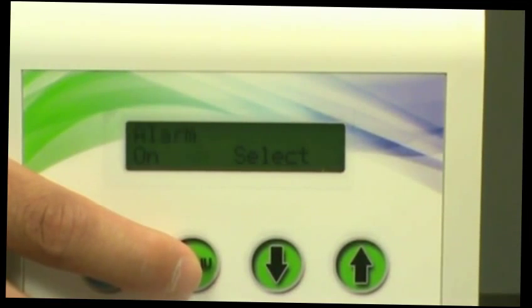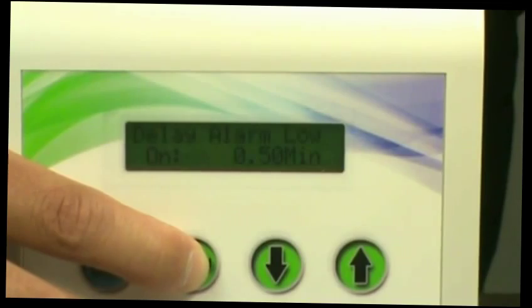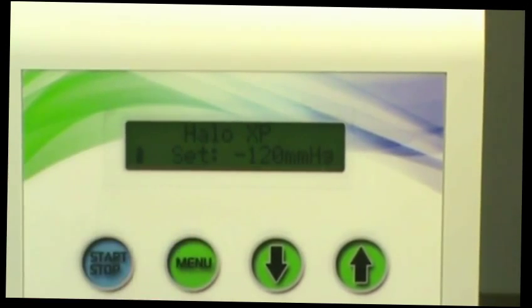Your alarm setting, make sure it's on. Your delay alarm setting as well. And this one we set it up for half a minute delay. Press menu again. It will take you back. Now let's go through the second menu option.